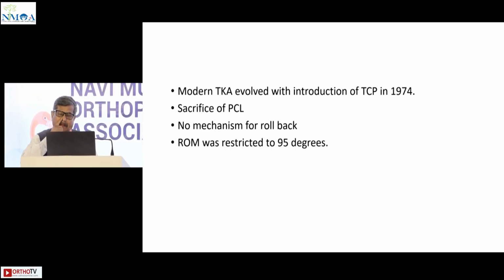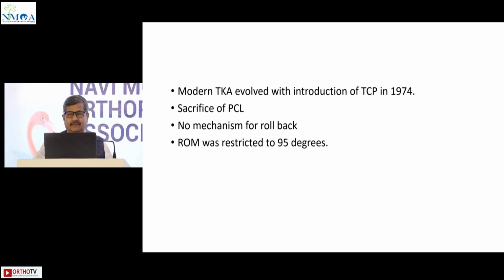My topic is in tricompartmental osteoarthritis, whether doing CR, PS, or medial pivot, does it matter? Now, as far as the CR and PS goes, the debate has been going on for years and years together. Every conference has this debate. Now, it is sort of an unresolved controversy.